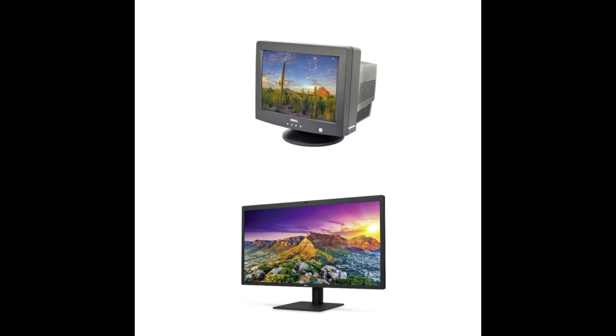Section 14.7, display. So now that we've mentioned the display, let's talk a little bit more about what it means to have the display and how it affects the image creation. So original units used basically really old televisions with cathode ray tubes to create the image. And if you have some older study material for the SPI, you might see a section in there on cathode ray tubes. However, that has been removed from the SPI at this point.